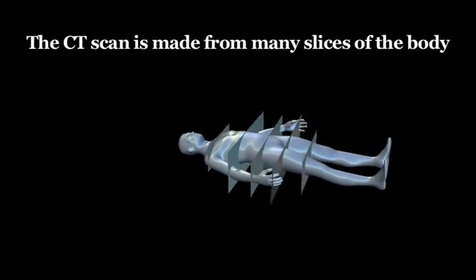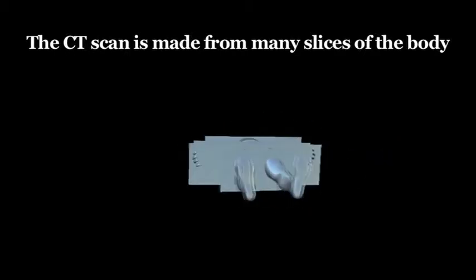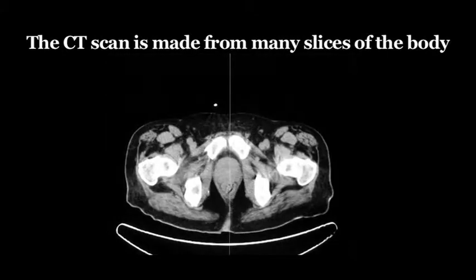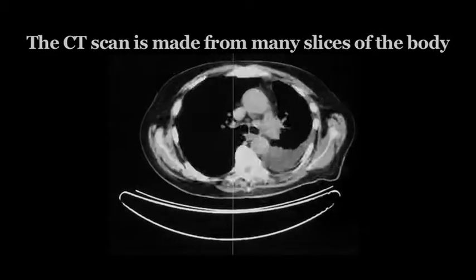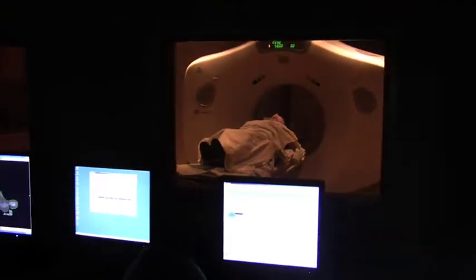It gives me the opportunity to evaluate your tumor just as closely as if you had contrast in the system, but you don't have to drink anything for contrast and we don't have to give any injections. This keeps the scan quite simple — you can eat before you come and go about your usual activities. The therapist will perform the scan and then bring me into the room to review it and make decisions on whether the quality meets what we need for treatment planning.